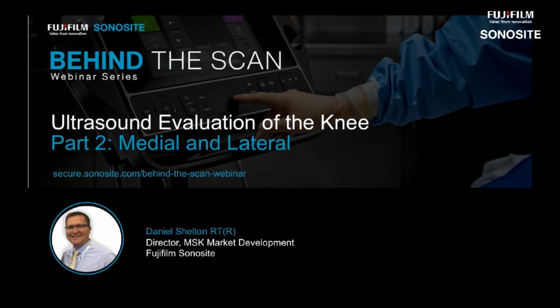We will cover dynamic valgus varus stress maneuvers and how to stress the knee and those limitations. So you want to look at meniscal pathology. Is that easy to see? Is it not easy to see? Where are the limitations? Where are the strengths of ultrasound? I think it's very important to have that conversation.